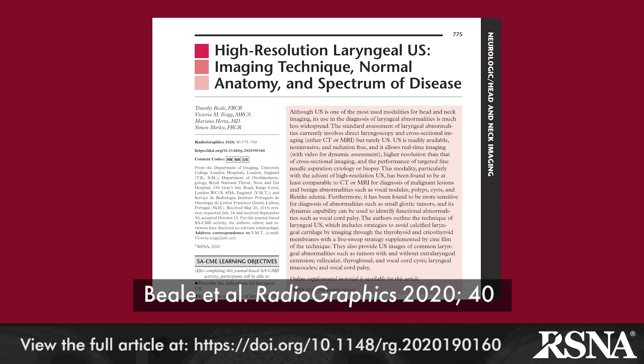It is clear that in skilled hands, high-resolution ultrasound provides a powerful tool for the diagnosis of malignant and benign laryngeal abnormalities.